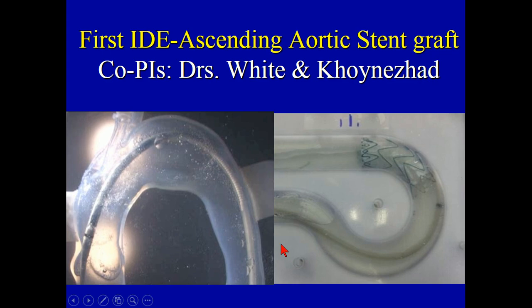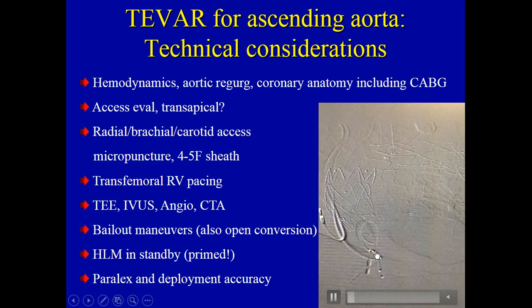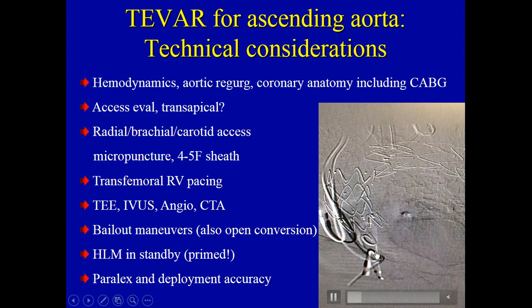Let's see if I can go back here and click on this. So if you look at the ascending, it's really much established just like a TEVAR.